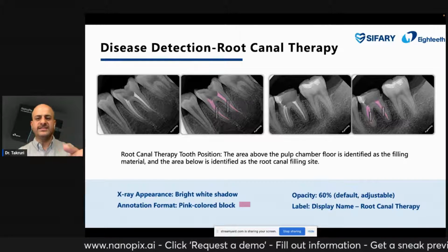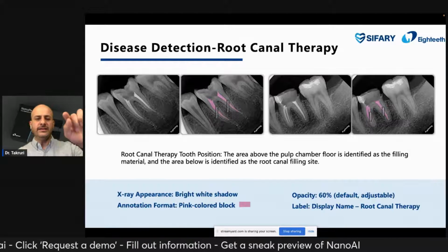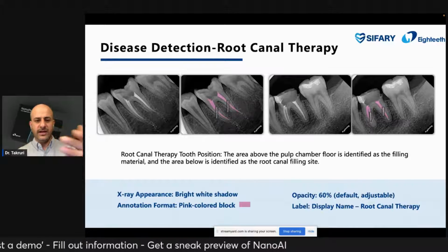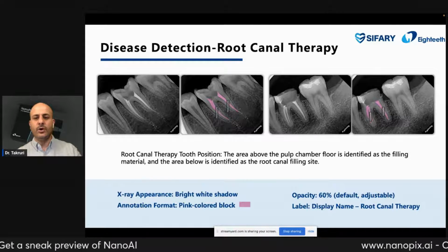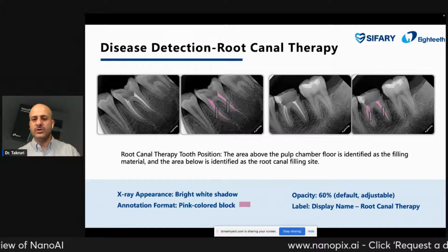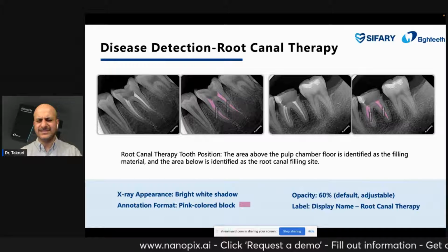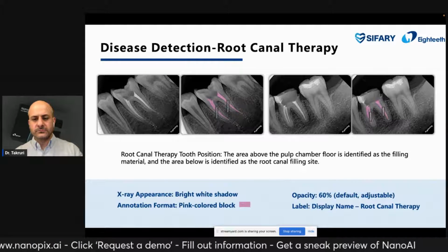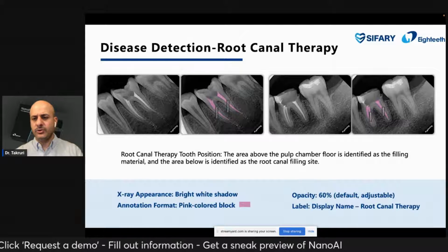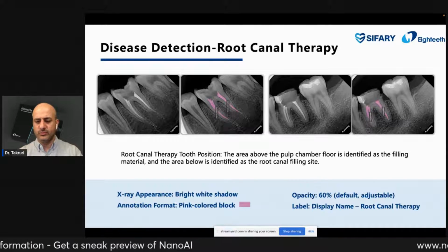It's overextended up to the bone, and you can highlight the tooth outline, and you will convince your patient that this tooth is overfilled. On the other side, you have an underfilled tooth, and you can communicate with the patient easily in two words only: you have an overextended X-ray, or you have underfilling here. Just coloring it to your patient, and your patient will be amazed.